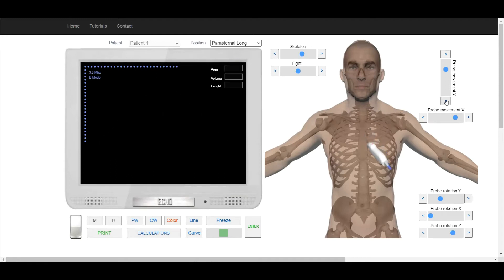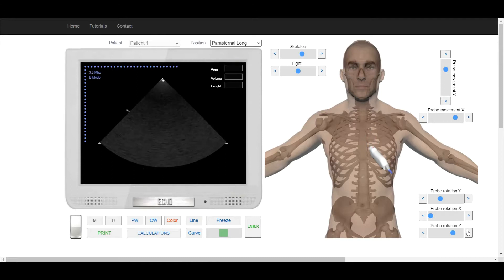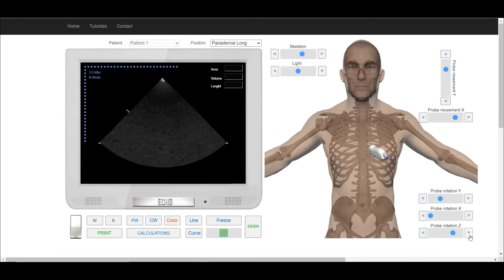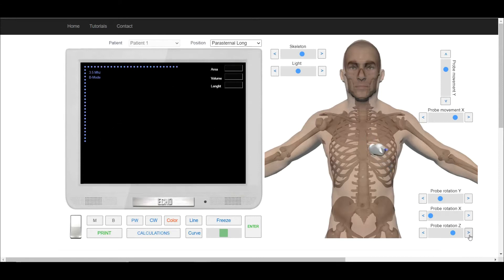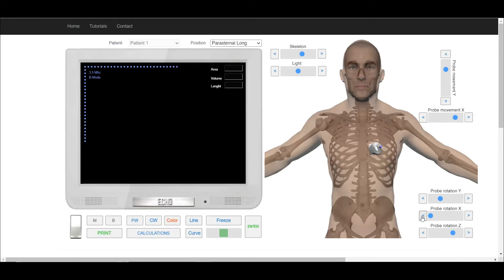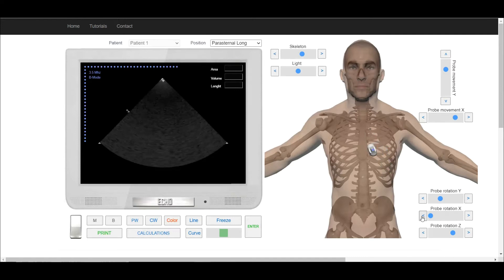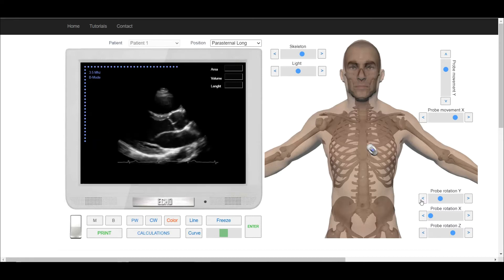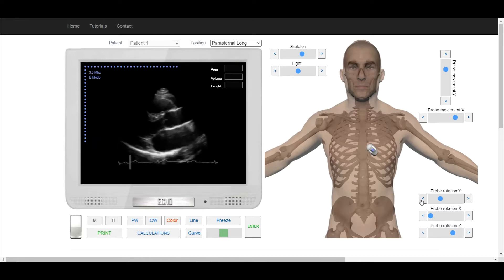Use the appropriate sliders and buttons to move, rotate, and tilt the transducer in all directions. To obtain the short axis at the level of the aortic valve, first we have to obtain the long axis of the left ventricle. The red marker of the transducer points somewhat towards the right shoulder.